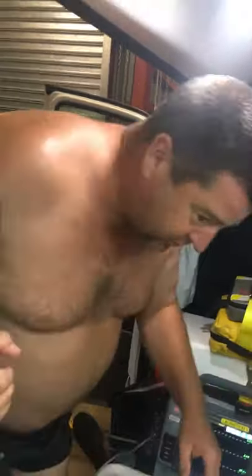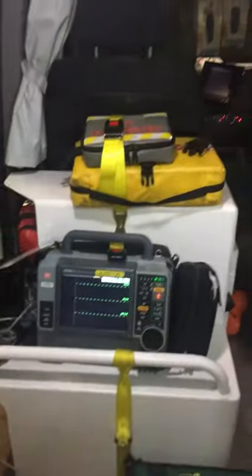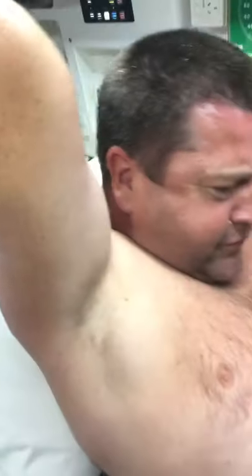The first instruction is to your patient: whip their shirt off. Sorry about this form of abuse seeing me without my shirt on — there's always a little bit of pain in learning. Trying to avoid my hairy back. Watch out for the belt buckles — they're in some funny spots.